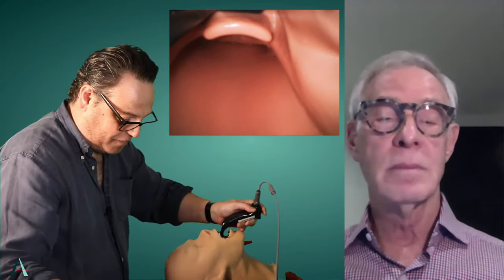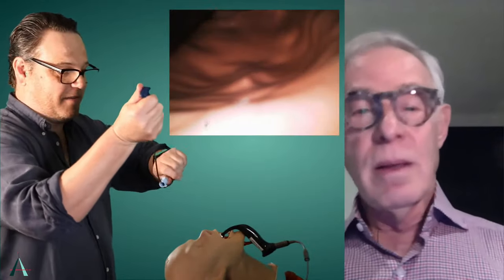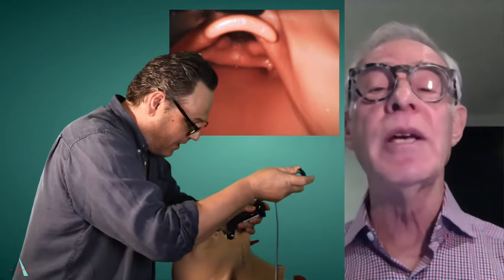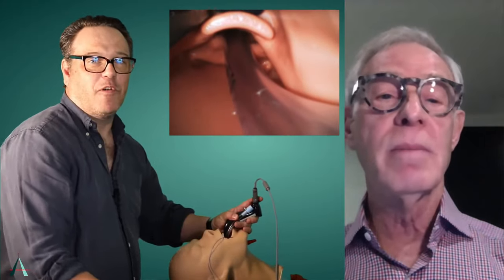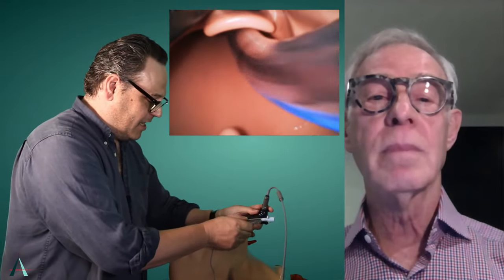Shall I just do a fluid one with the tube now, just to show what it should look like? You can, if you want to show off. I'm not sure that it'll be showing off. We'll see what happens. But having said that, Nick, I would really encourage people to do it in a deconstructed manner until they're comfortable. So that's just to demonstrate what you're ultimately aiming for and that it's not a slow technique. I now find it faster than doing direct laryngoscopy. Okay, so that's really the basic steps.